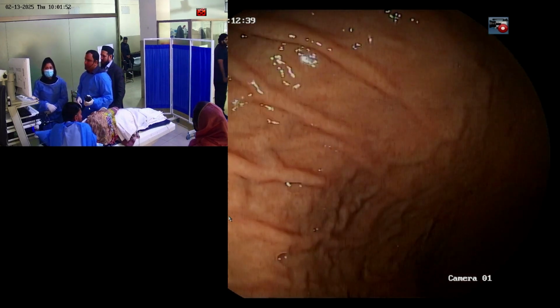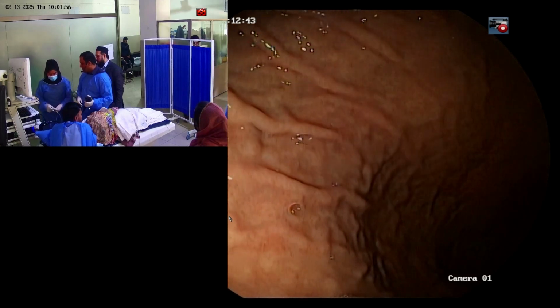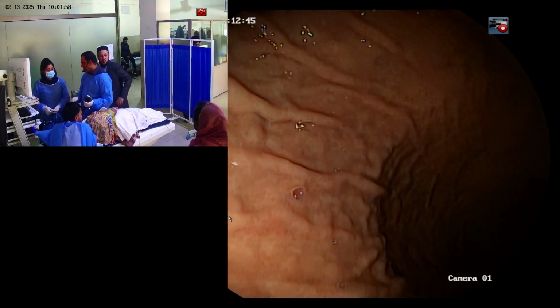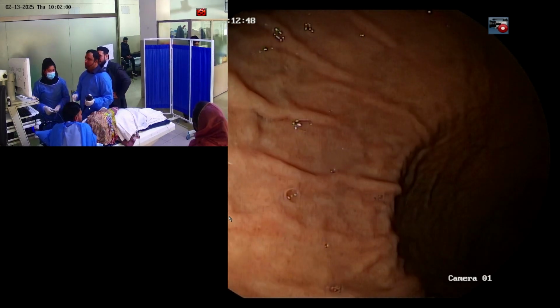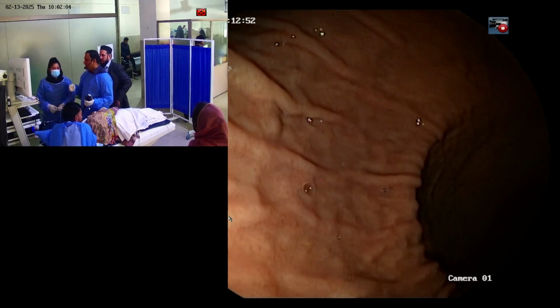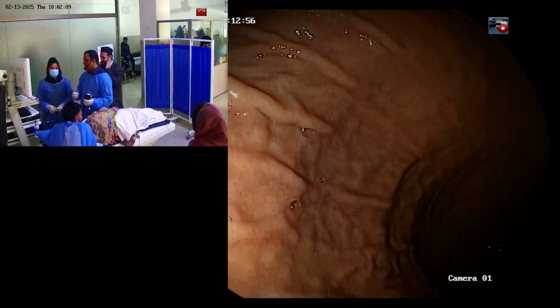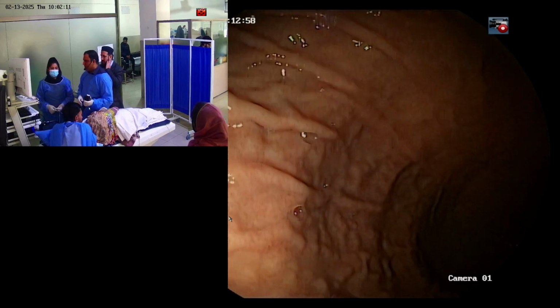If the tech is new, I checked the needle before we had the meeting, before I did the endoscopy. A 21 gauge needle is the go-to needle, and ideally we should be wearing goggles, because in the event of some spillage, it can cause significant damage.